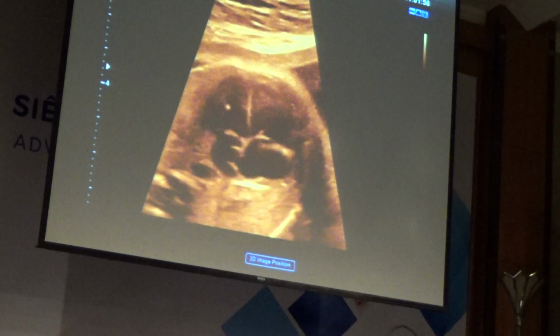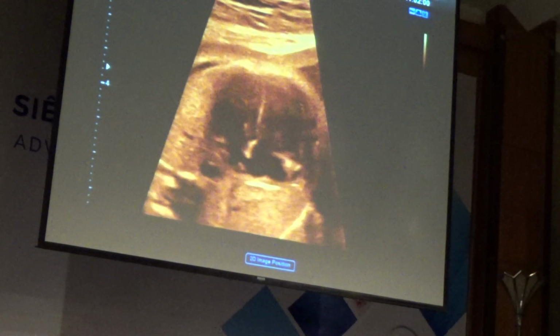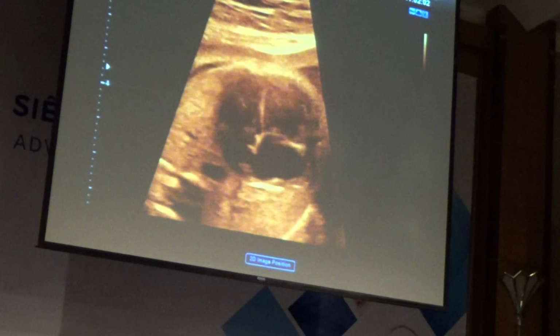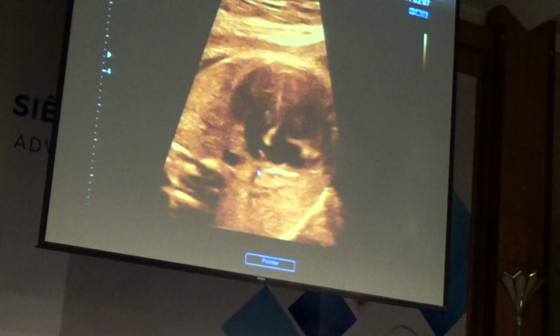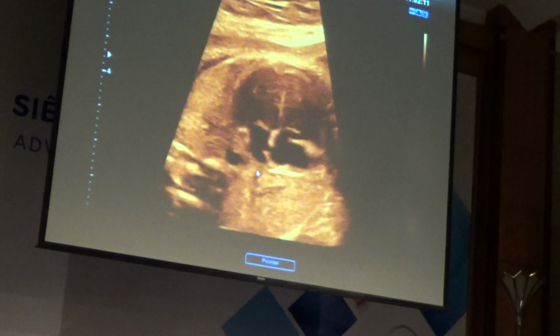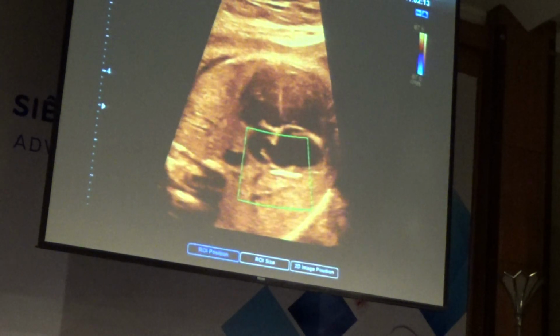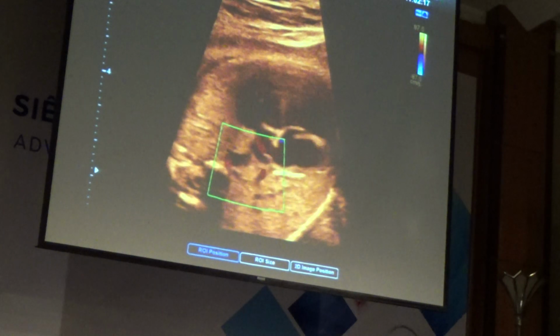Even though my favorite view is going perpendicular, this is a good view first to look at the pulmonary vein. See the pulmonary vein I see here, so I know it should be red when I turn on the flow. And here you see it very nicely.